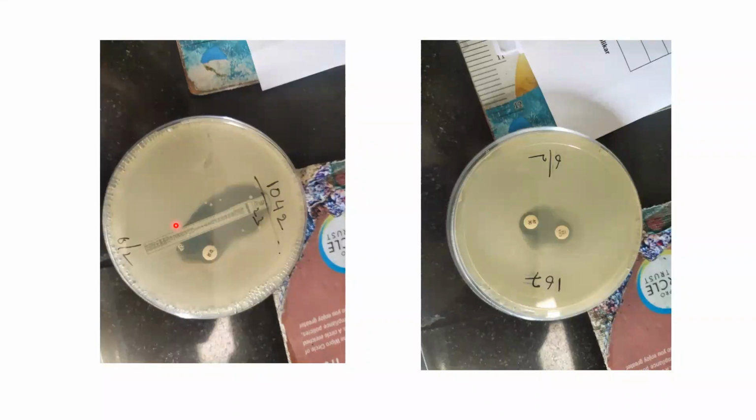Sir, this adds more questions in my mind. Let us take either this example or this example. Now you have got two antibiotic discs that they're studying. What you have explained is understandable. My question is, how did microbiologists choose these two antibiotics only? Why not choose aztreonam plus clindamycin, for example? Why Zavicefta and aztreonam? How did they come to the conclusion?